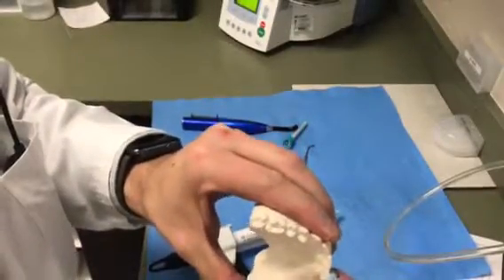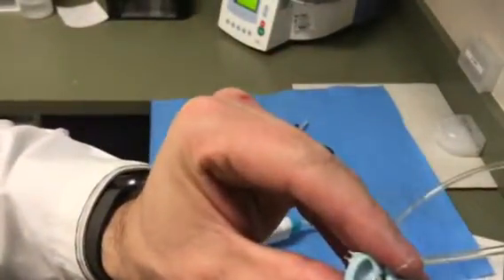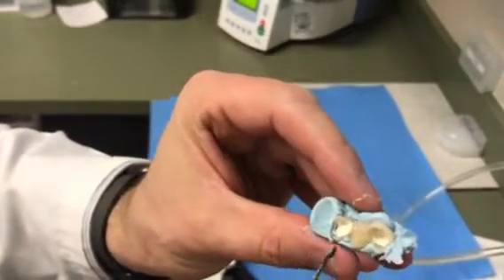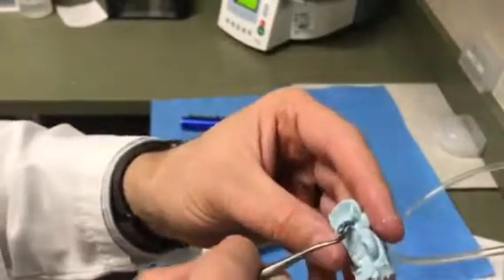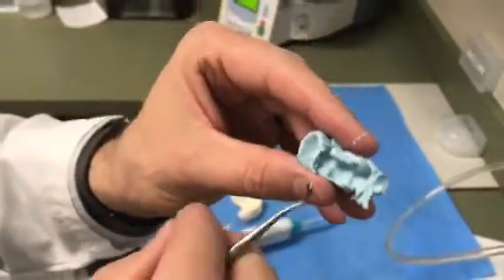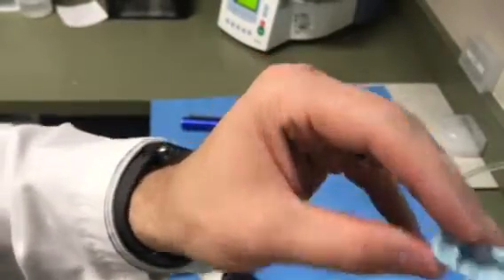All right, so we take that out. So the lab is able to see how much of an open contact I have here, and they can see some of the deficits in contour and things like that by getting a mold like this. In the areas that it's pretty closed, you can see that too. So they can use this as a quick way to judge where to add and by about how much thickness to add. So not amazingly accurate, but still, in a pinch, this has definitely gotten the job done for me multiple times.